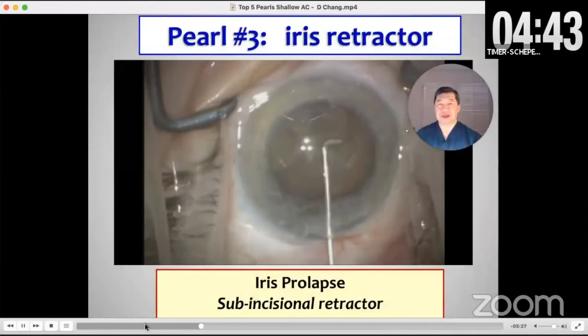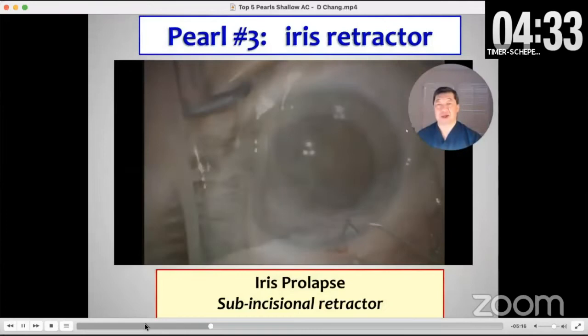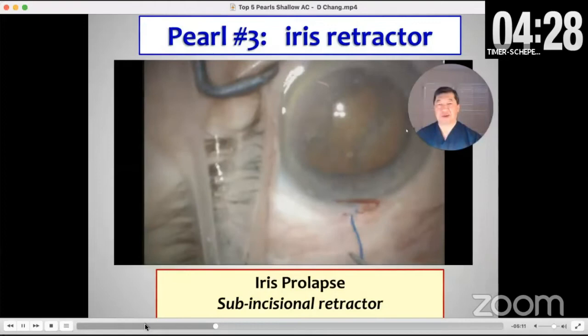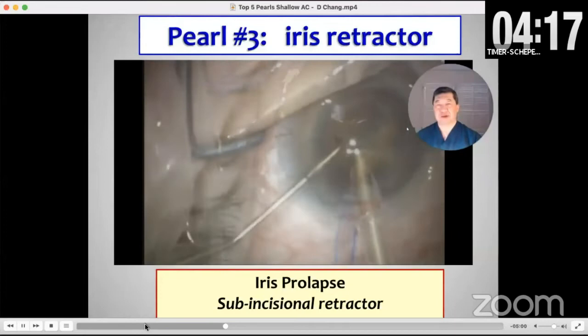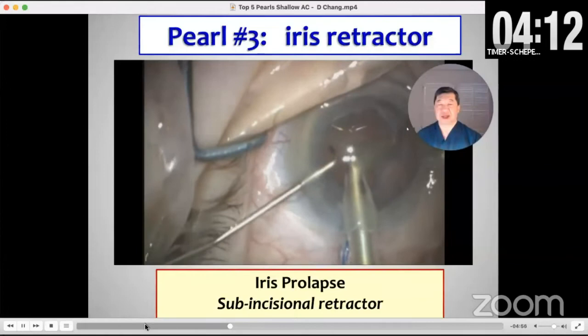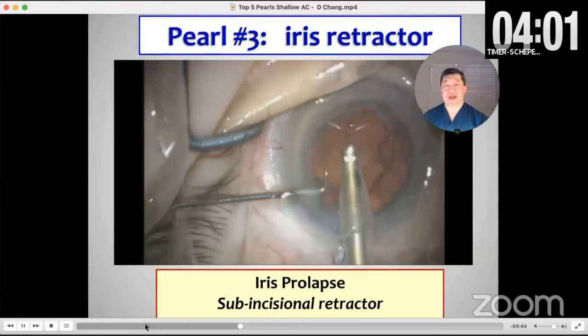Pearl number three is to use a subincisional iris retractor the minute you get any iris prolapse. I don't need four retractors — the pupil's still large — but if I keep inserting instruments over that iris, it's going to fray it and cause further trauma. So I stop and place a subincisional retractor through a different clear corneal stab incision so that my instruments go through the clear corneal incision and are not rubbing against the retractor. You can see how when I do both the phaco and later the I&A, this pulls the iris down and out of the path of the instrument so we don't further traumatize it.